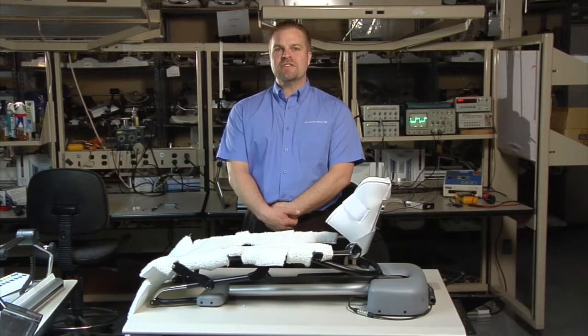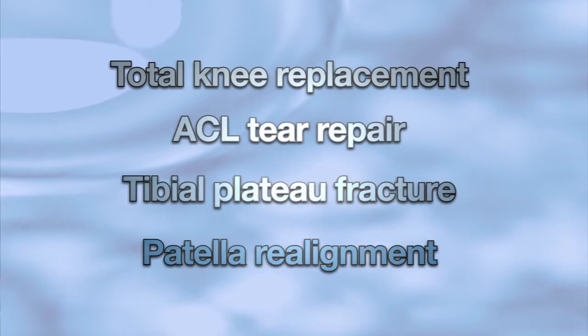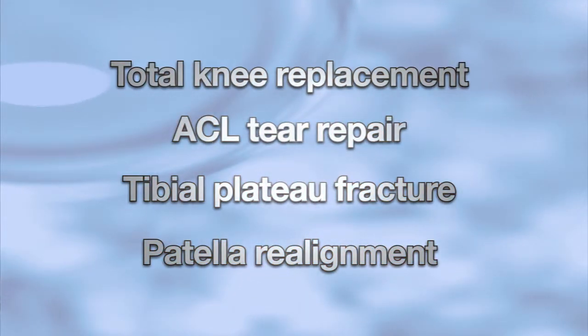A CPM machine is generally used following a total knee replacement, ACL tear repair, tibial plateau fracture, patellar realignment, and several other procedures performed at your facility.